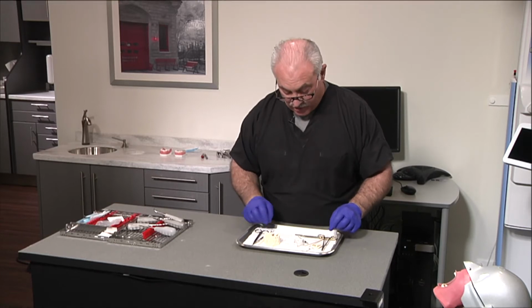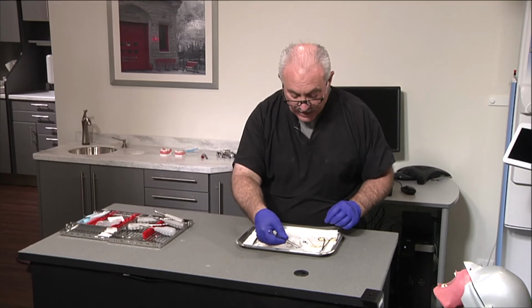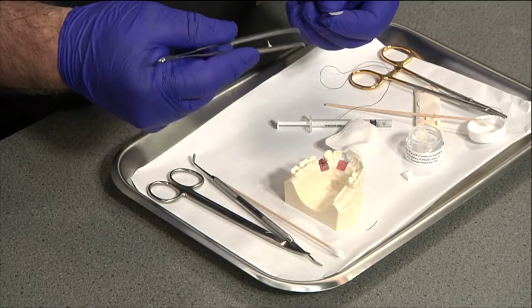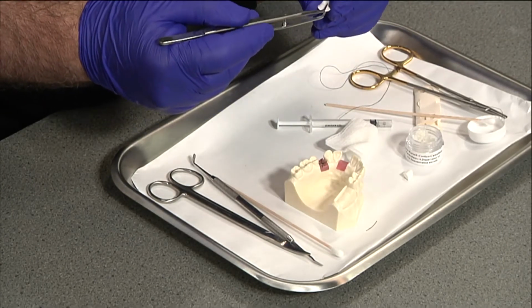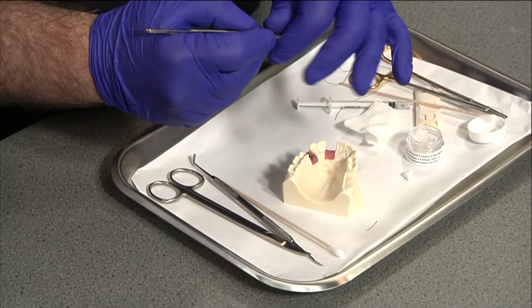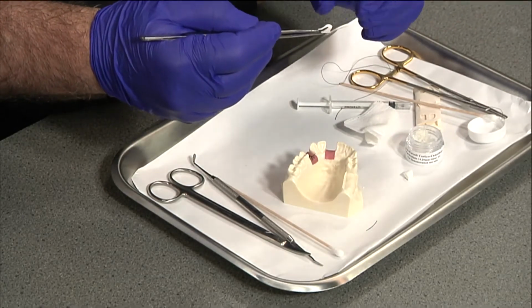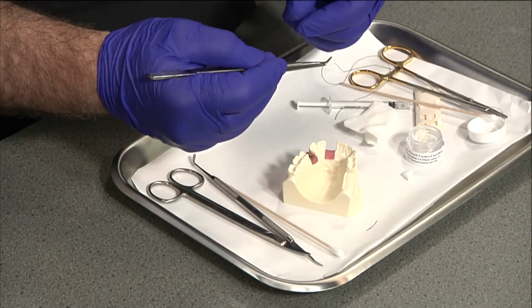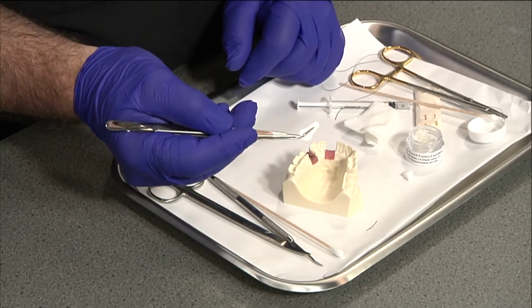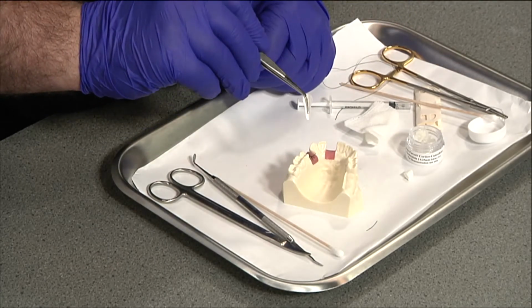The next thing I want to show you is how to use the socket repair membrane, which is ingeniously designed for the clinical scenario where we have a labial dehiscence from a chronic broken down incisor. It has a facial fenestration, and underlying that is a lot of granulation tissue, inflammatory tissue that has caused erosion of the bone. You hold it from the top down, kind of like an ice cream cone, and you deliberately make a crease, almost like a 45-degree angle.